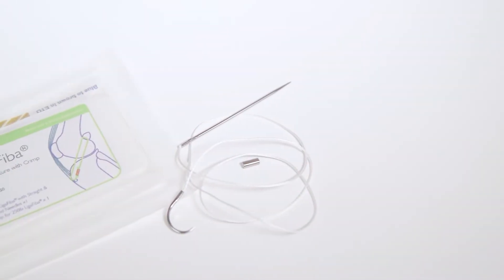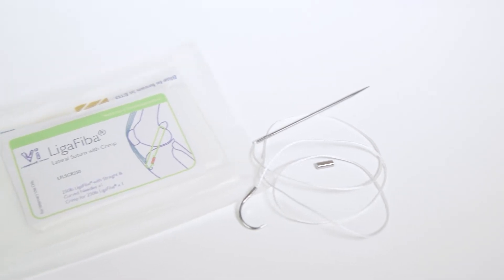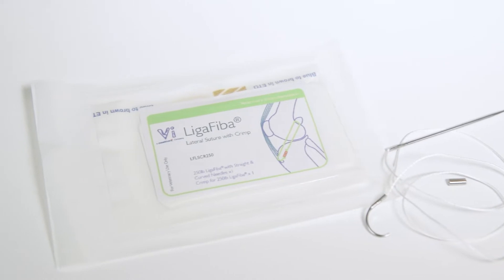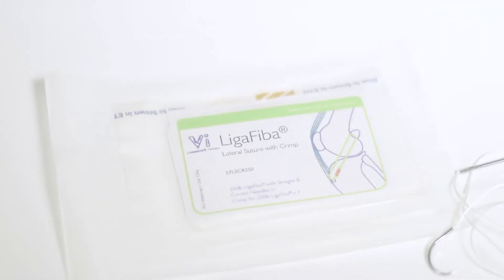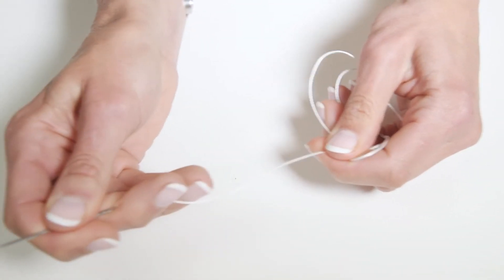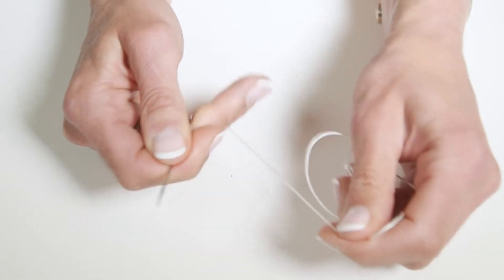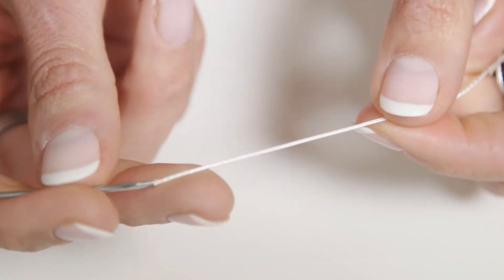A modern alternative to nylon from VI is liger fibre. Liger fibre is a multi-filament line composed of braided ultra-high molecular weight polyethylene. Weight for weight, liger fibre is two and a half times stronger than nylon, and has better resistance to abrasion. Liger fibre is much easier to handle than nylon.